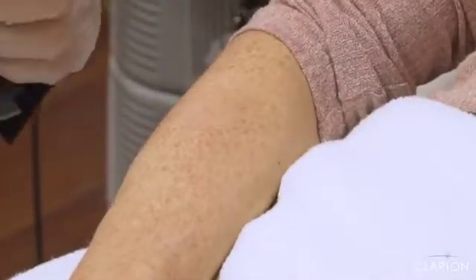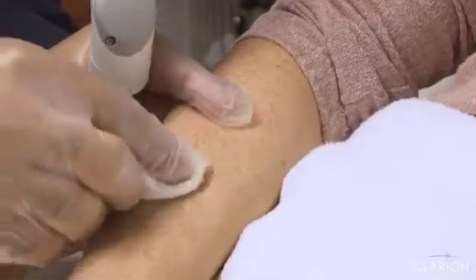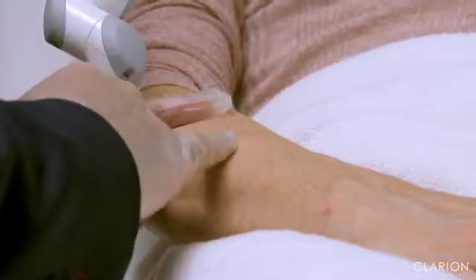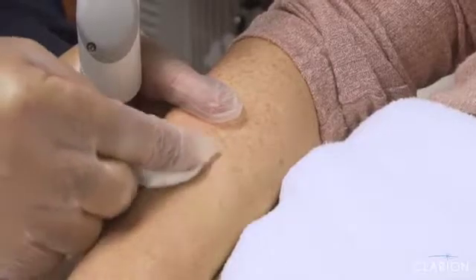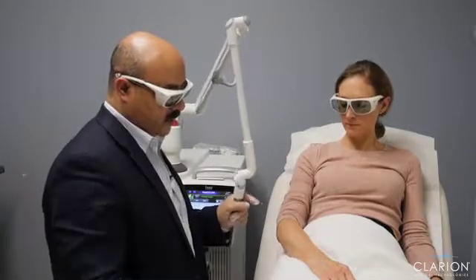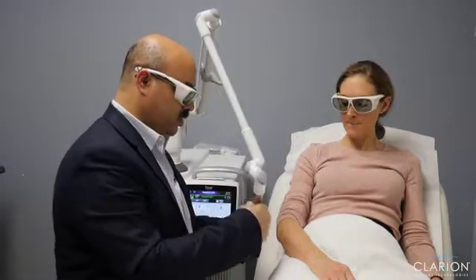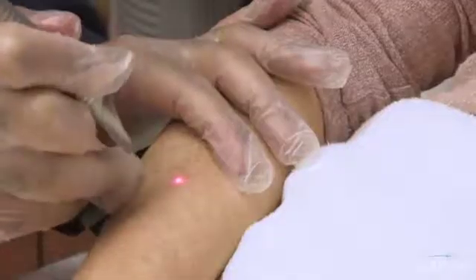How is the pain? Barely anything at all. Okay, so we can see that the pigment is almost gone. The skin was peeled off with the pigment, and usually it will take maybe 3-4 days for healing, but we get rid of the pigment. We can target the edges so that we are sure that there are no remaining lesions.